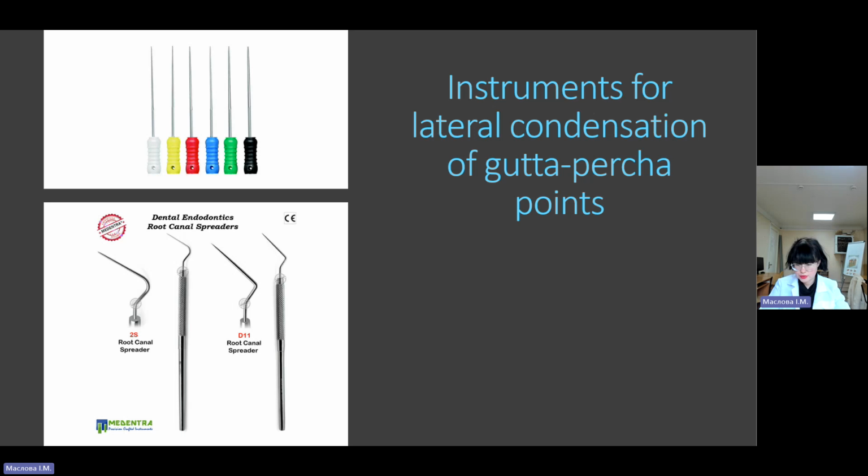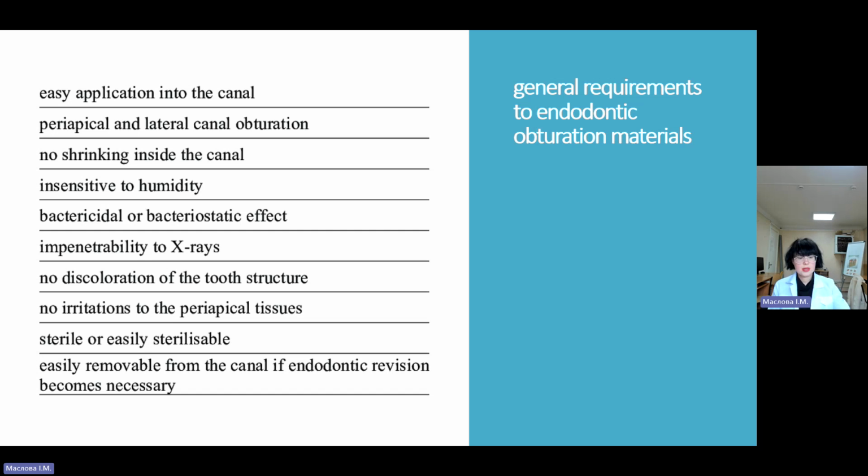Root canal obturation materials and root canal obturation systems. First of all, I want to show you the general requirements for endodontic obturation materials.